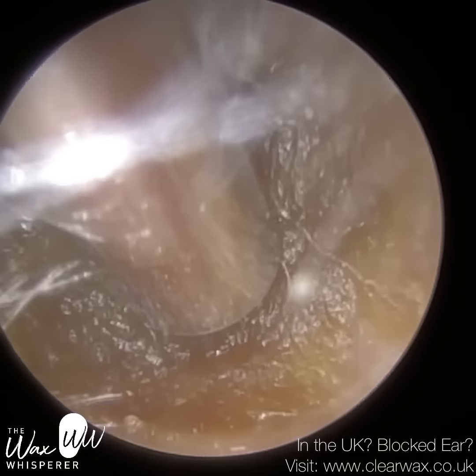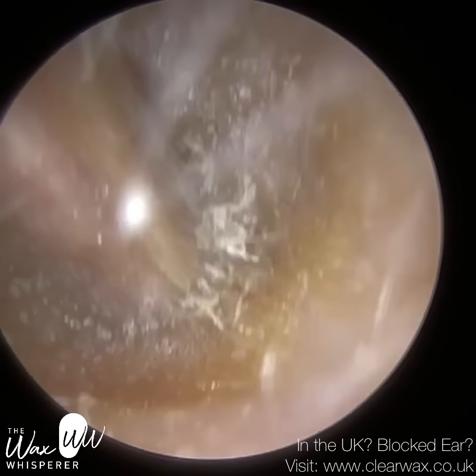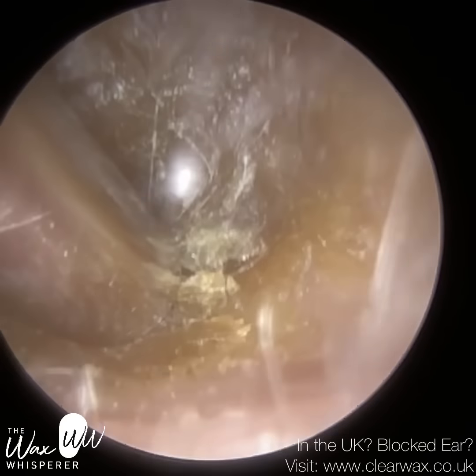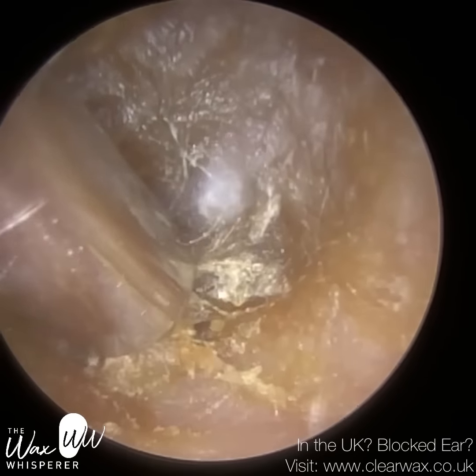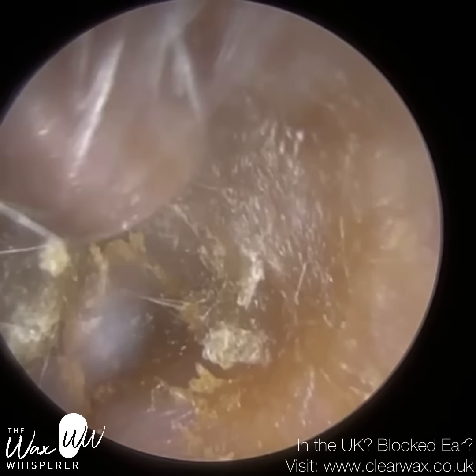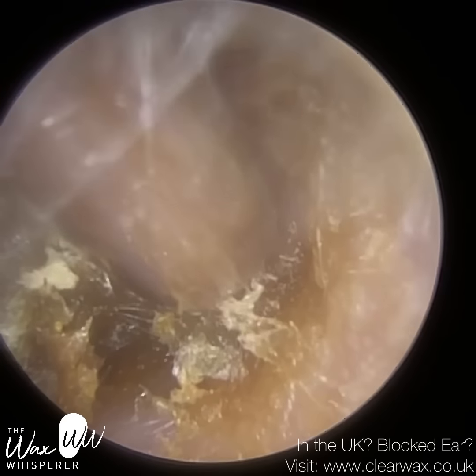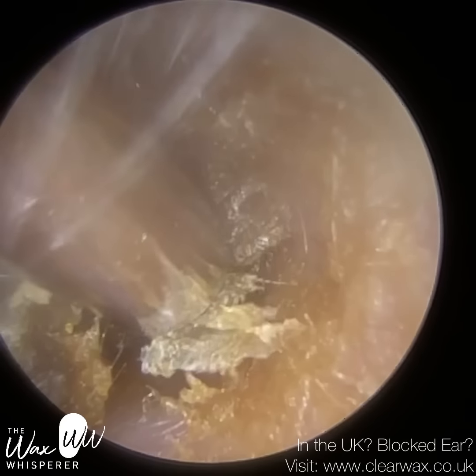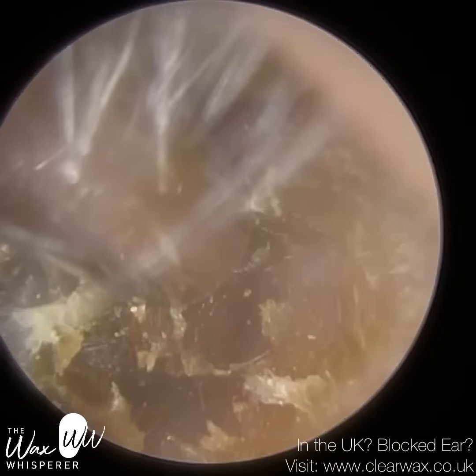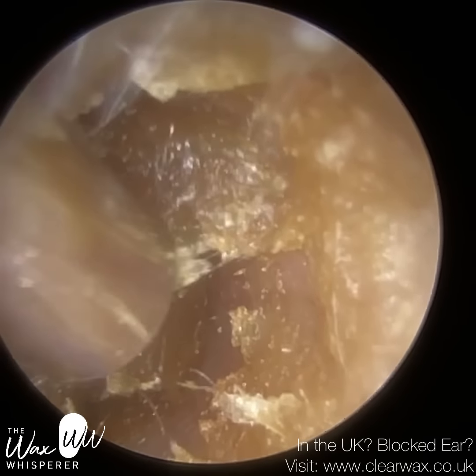This is of a patient who attended with really severely blocked earwax in both ears, and we're just commencing with their left ear. There's several challenges in this particular case, the main one being the narrowness of their ear canal. And I'm just using the standard Zollner suction probe, and it was more the entrance of the ear, and because of the narrowness, it was a bit difficult to manipulate the suction probe and also the endoscope simultaneously within the ear, but we did manage.